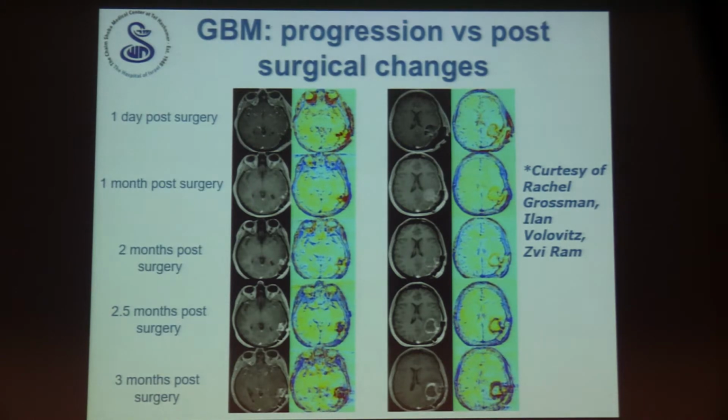And at least in our hospital, some of the doctors use the residual tumor they see in the TRAMs to give a boost to specific regions of the surgery site. But I don't think they would trust that if the TRAMs don't show blue, there still could be small cells that we don't see because we are really sensitive to the vasculature of the tumor. So we need some kind of a macroscopic tumor in order to see it.